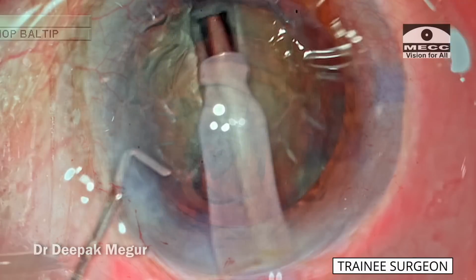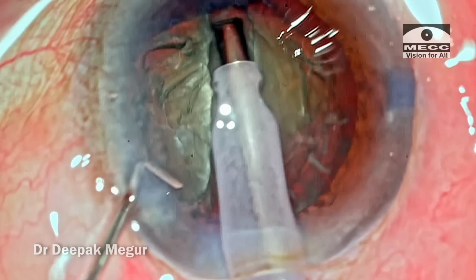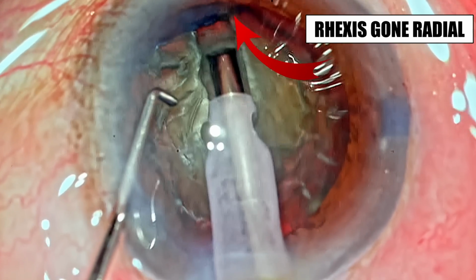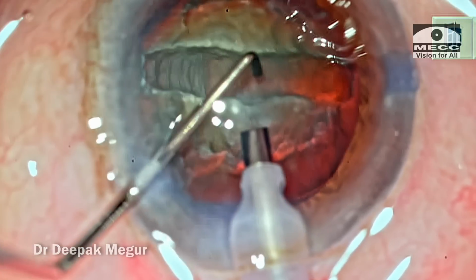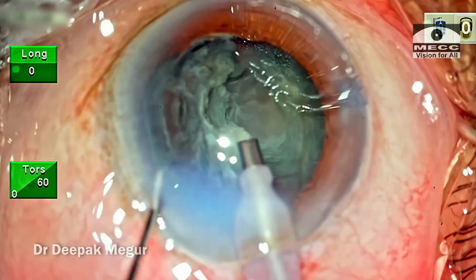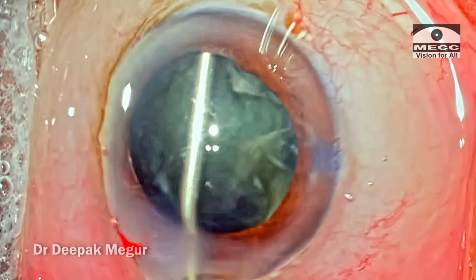Now, this is a trainee surgeon who's doing phacoemulsification, and unfortunately the rhexis margin is touched by the second instrument. It is actually a blunt long Sinskey hook and it has gone radial. The surgeon has not realized and he's continuing to phaco, and after some time he realizes that something is wrong and the nucleus is not stable and he calls for help. And this is the time I take over.